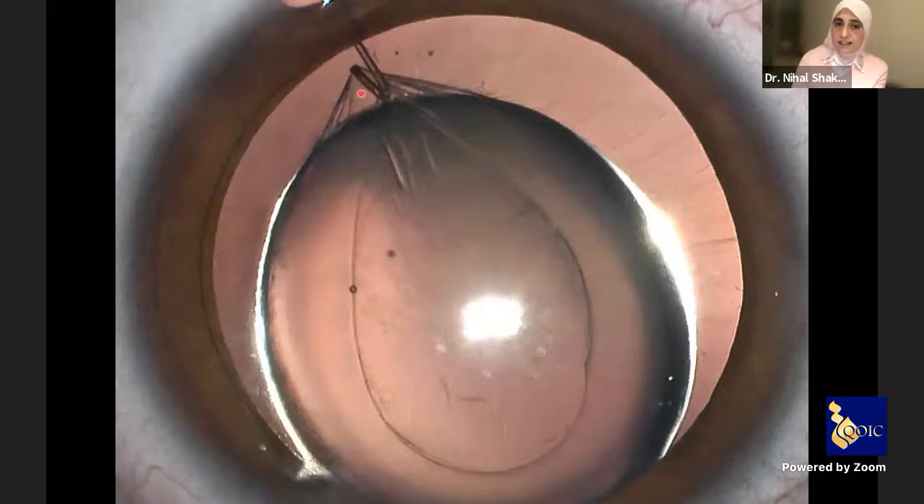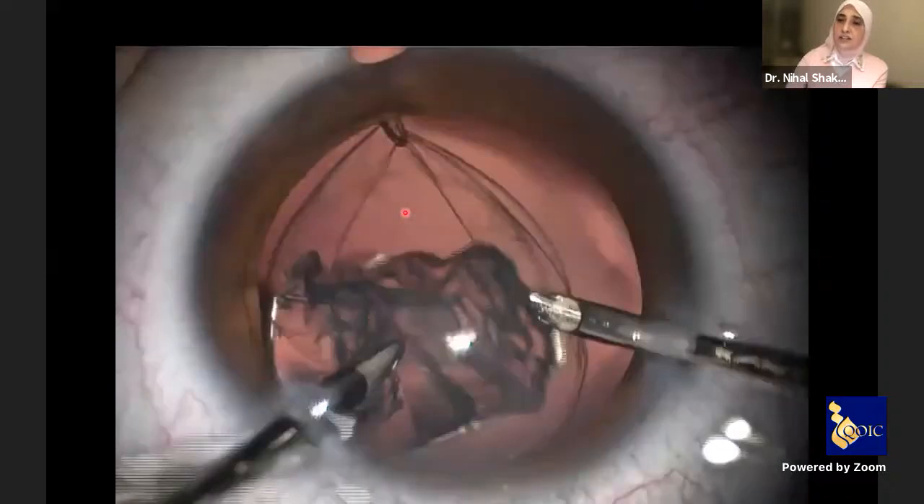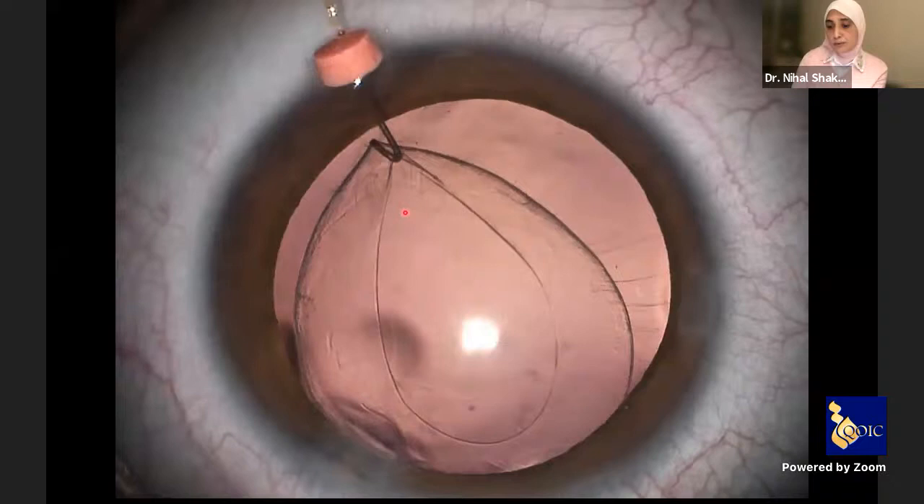Here there is a sort of a tent — a complete separation of the capsule from the cortex. It has a beautiful advantage: you can go through this tent and perform hydro dissection. In this case the irrigation aspiration is going to be very easy and will take just a few seconds; you just go in and never out until you finish irrigation aspiration.